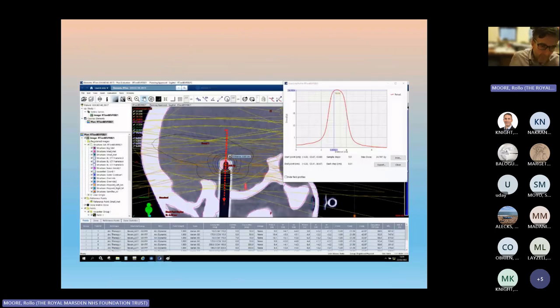And what that enables us to do is take the CT scan and calculate the dose within the planning system, which is the predictive calculating model. We call it the TPS. And what I've done here is all those yellow lines are very complicated overlaps of where the radiotherapy beam is going to, in fact, intersect with the lesion on this screen from the different arcs for different couch rotations.